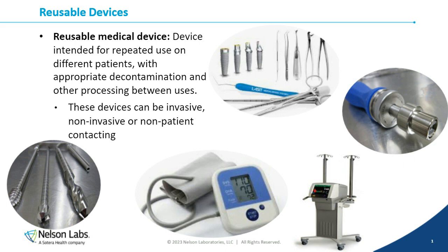What we have pictured here are just some examples. We have surgical devices, blood pressure cuffs, and even monitors, those non-patient contacting devices that are sometimes viewed more as capital equipment. Those are reusable medical devices, and as such need validation work for their cleaning and disinfection procedures.